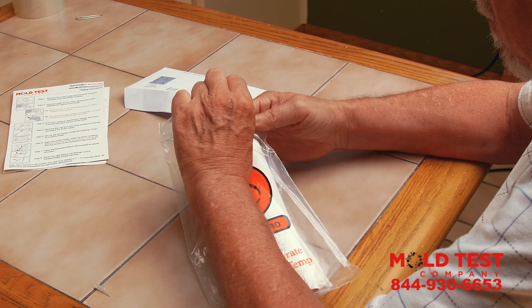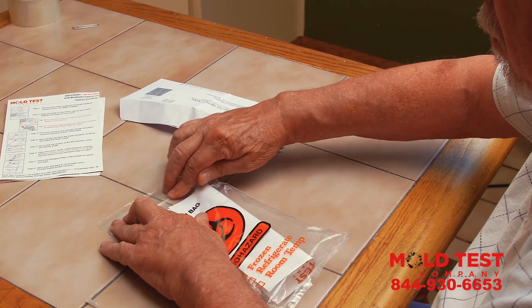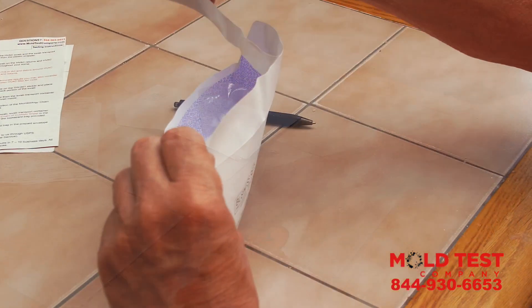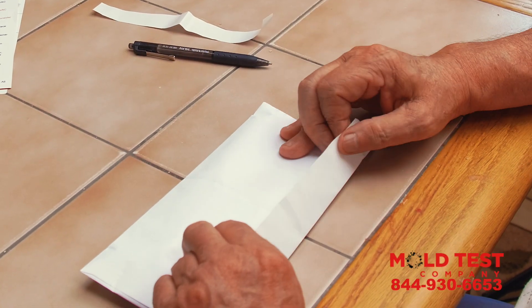Step 6. Place the HVAC swab, swab transport container, and microbiology chain of custody sheet in the Ziploc portion of the biohazard bag provided. Then, place the biohazard bag in the prepaid envelope.